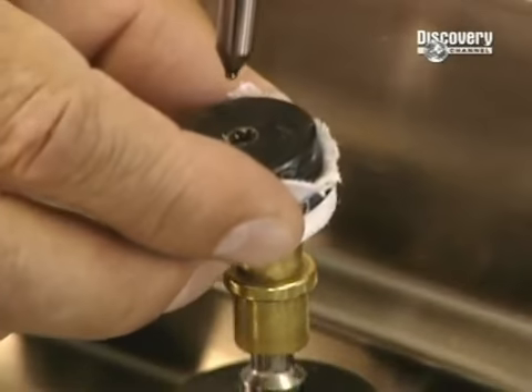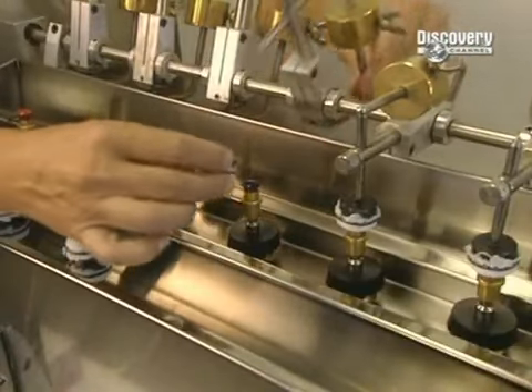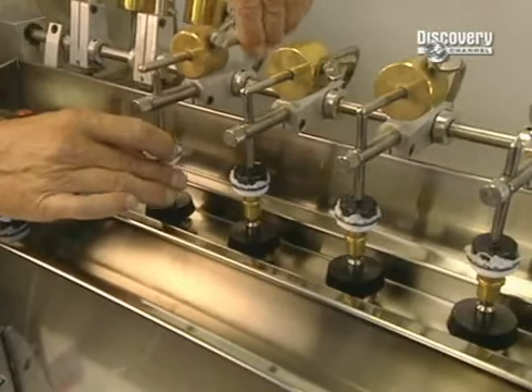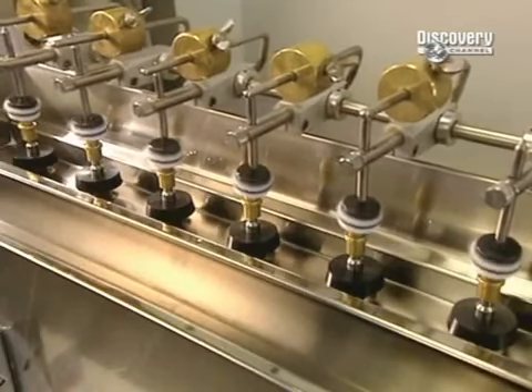This polishing, done at high speed, calls for an abrasive paste, some oil, and a small polyester cotton-like ball. This apparatus polishes several lenses at a time — a step that takes only 60 seconds.